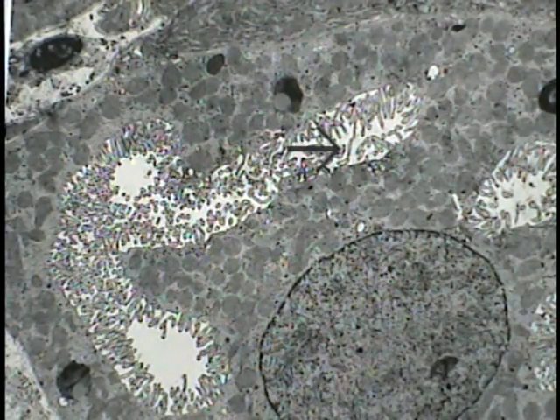This is an additional transmission electron micrograph of a stimulated parietal cell. Note the following differences as compared to the previous section. The canalicular size and lumen is much larger. It shows a much greater development of microvilli projecting into the canalicular system in comparison to the non-stimulated variety, as well as the loss of the tubulovesicular component within the surrounding cytoplasm, though a little remnant remains here.